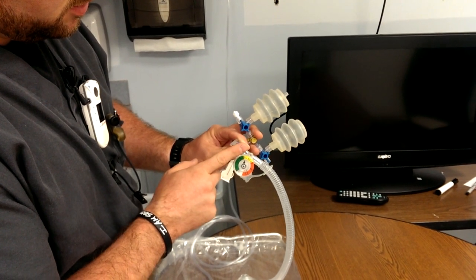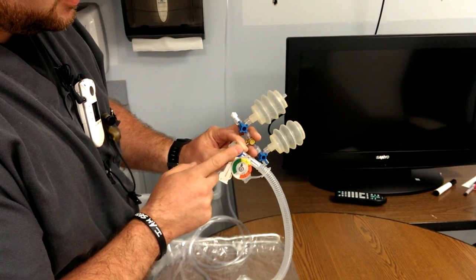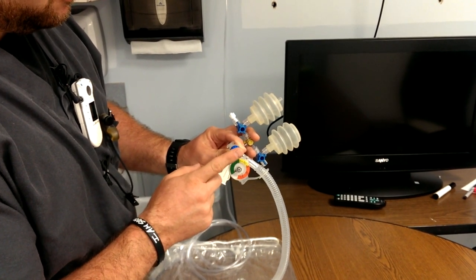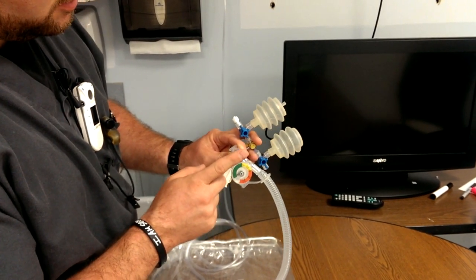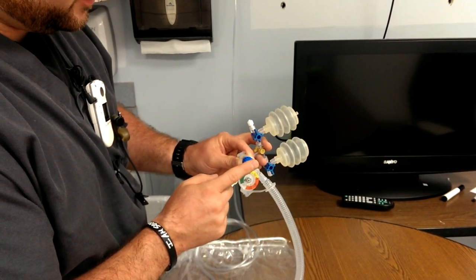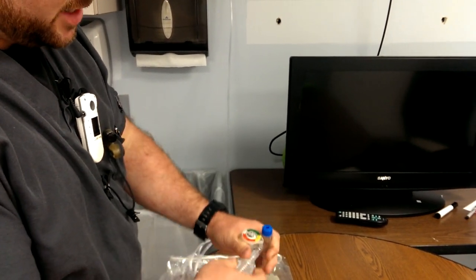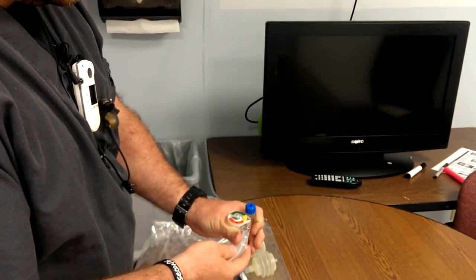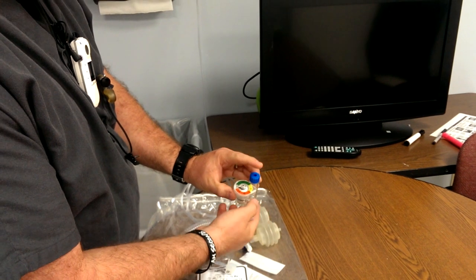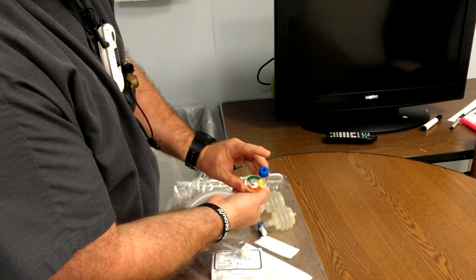This rate would be too fast. This is too slow. Somewhere in the middle — about 40 per minute. It will also adapt to a mask. If you seal the mask on the child's face, it's going to give them CPAP. If you occlude this hole, it will ventilate.